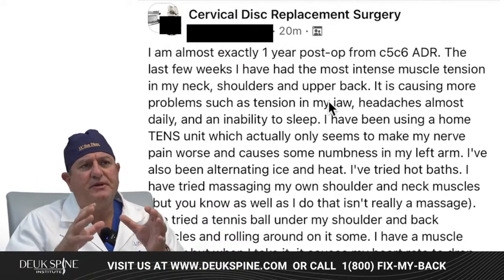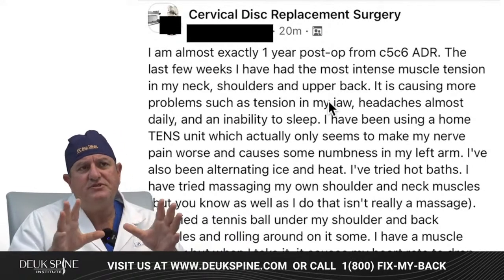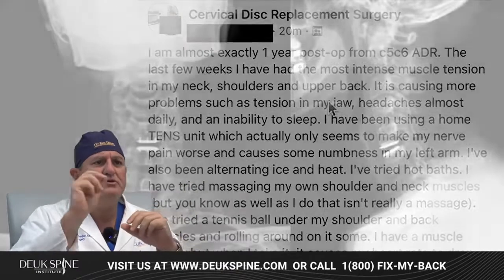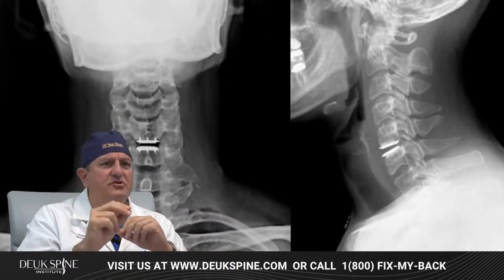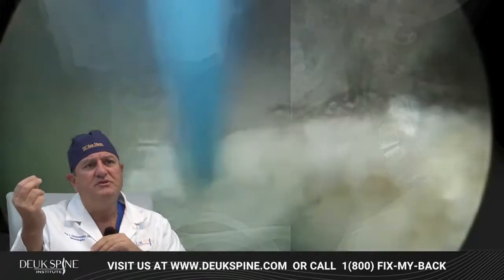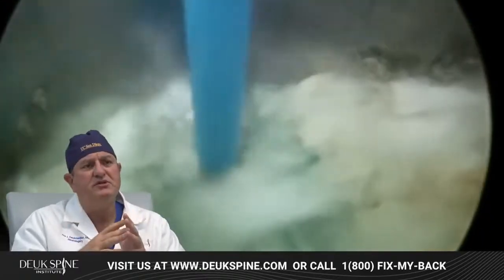So here's a patient who went in with one bad disc in their neck. They could have had the Deuk laser disc repair, and that's one of the reasons we want to bring this to your attention. You have all this financial pressure from companies that want to put those discs in you so they can make money, and that's driving surgeons to implant these artificial discs that don't work well at all. While on the other hand, there's a new technology using endoscopic surgery, a tiny 4mm incision.